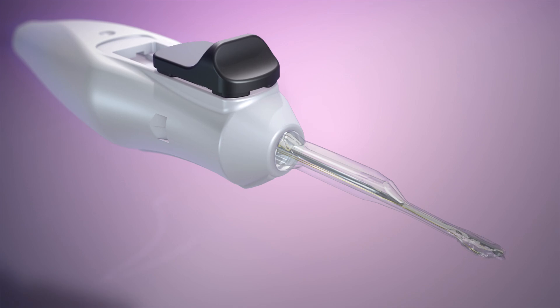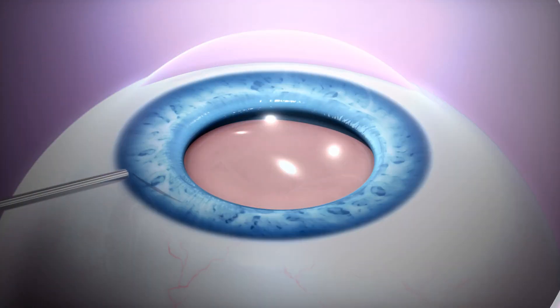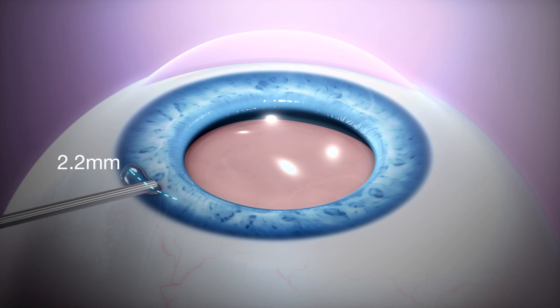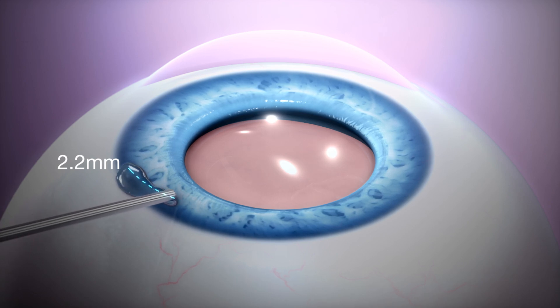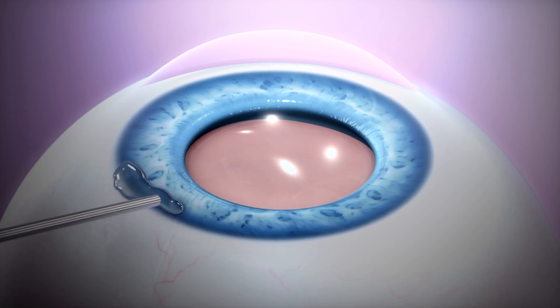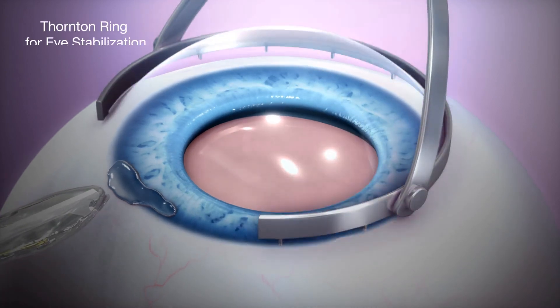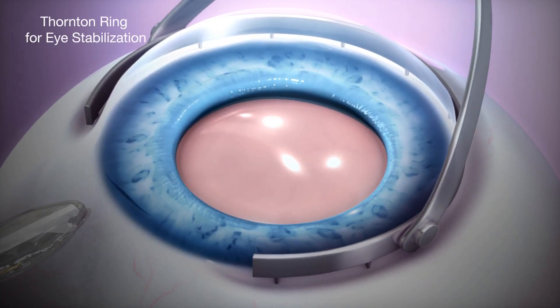Elongate the tip until a click is heard. Viscoelastic may be placed outside a 2.2 mm or greater primary corneal incision to assist insertion of the elongated tip. A Thornton ring is recommended for eye stabilization.